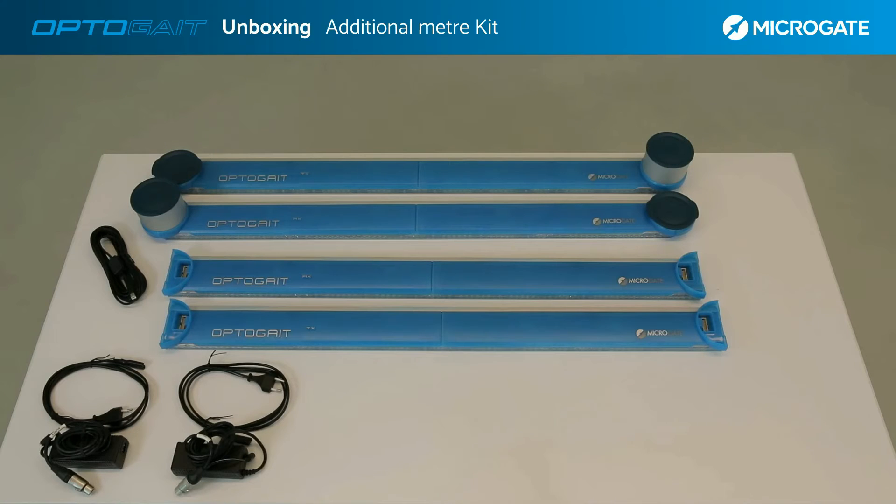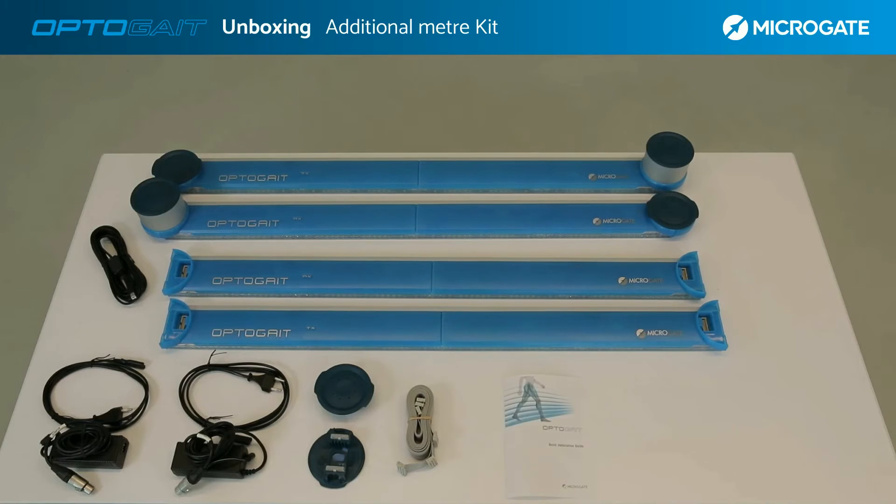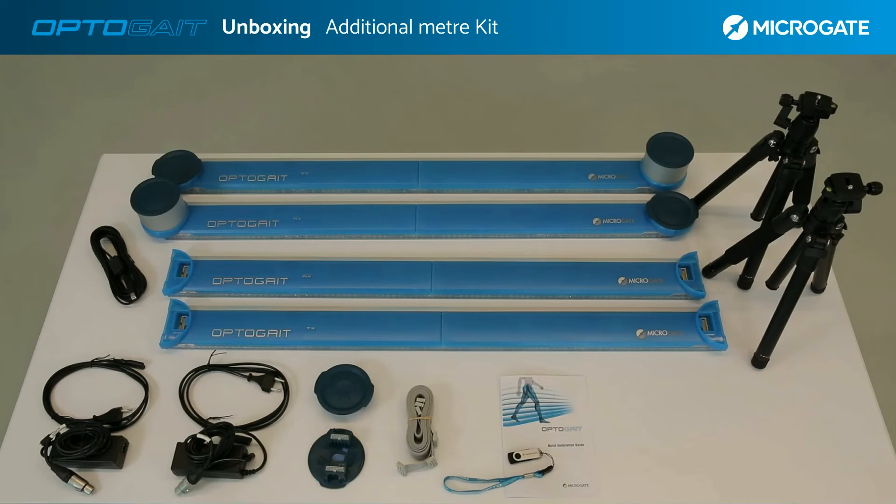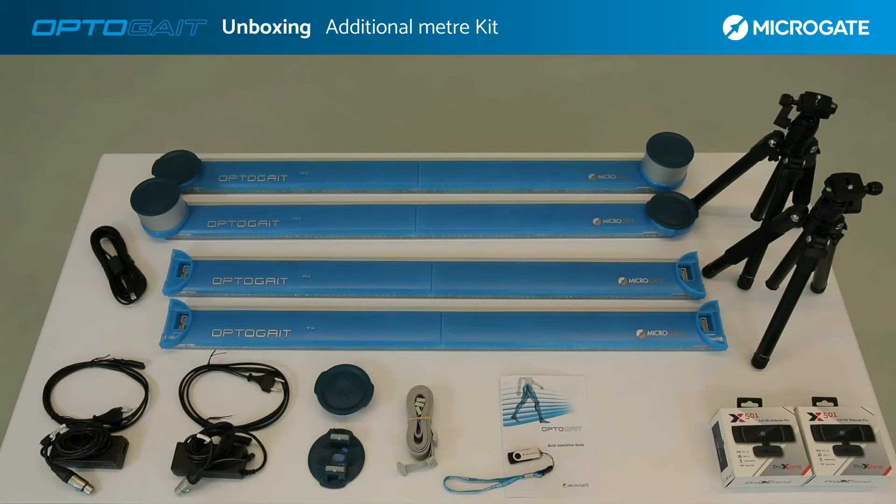In the case of adding additional bars, connection plugs are provided for standard installations. Flat cables are also supplied for greater flexibility and extension of the system for 2D installations and configurations. A quick guide about the first startup is available with a USB stick containing the user manual and software installation kit. Two tripods from 42 centimeters up to 125 centimeters allow the installation of webcams or any device up to a maximum weight of 8 kilograms, along with two 30-frames-per-second webcams with the option of 90-frames-per-second webcams for more detailed video analysis.